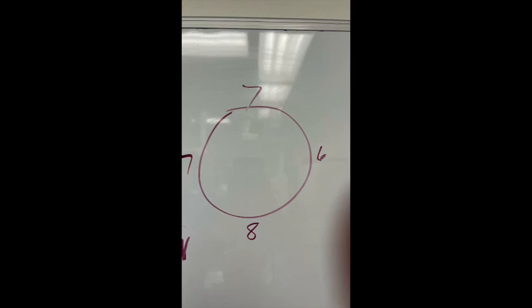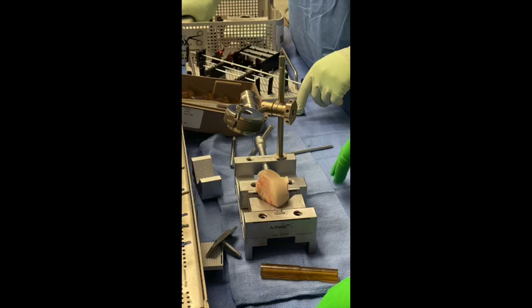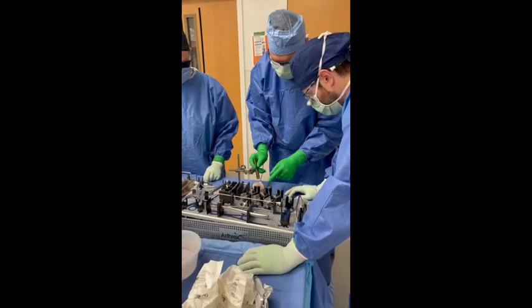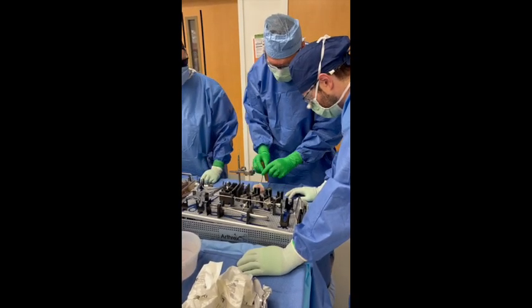We reamed to a depth of approximately 6 to 8 millimeters and marked this carefully, then found a reciprocal site on a donor allograft lateral hemicondyle, which we contour matched with the 15 millimeter OATS set.